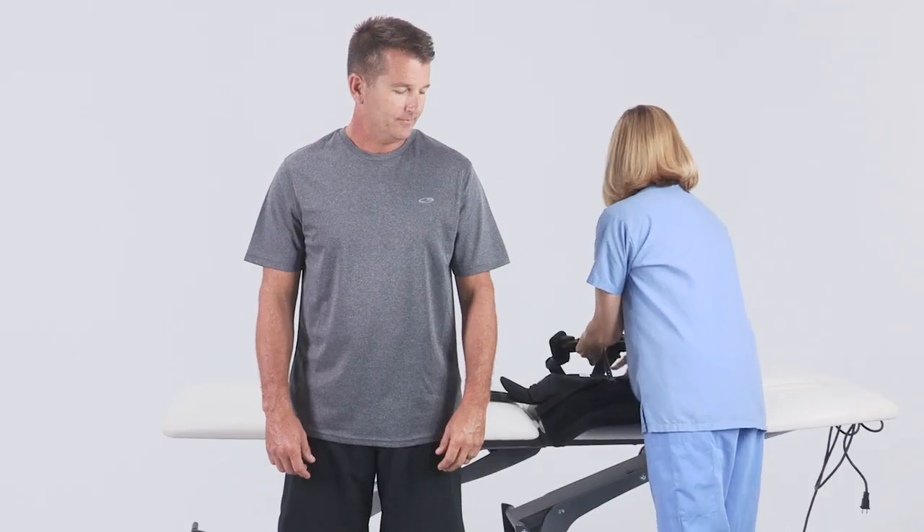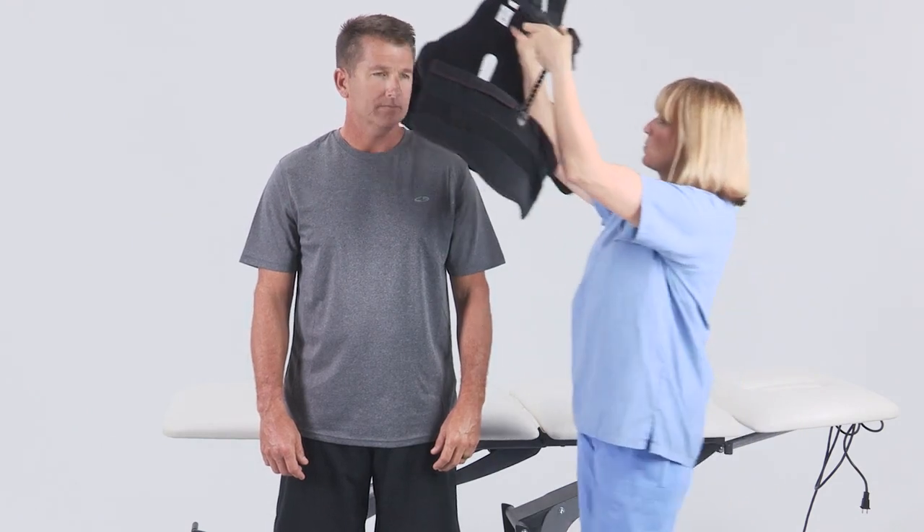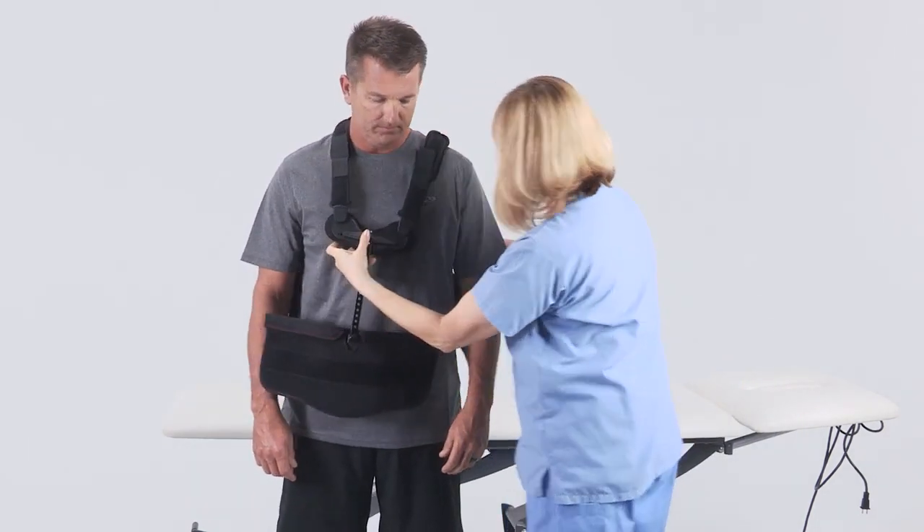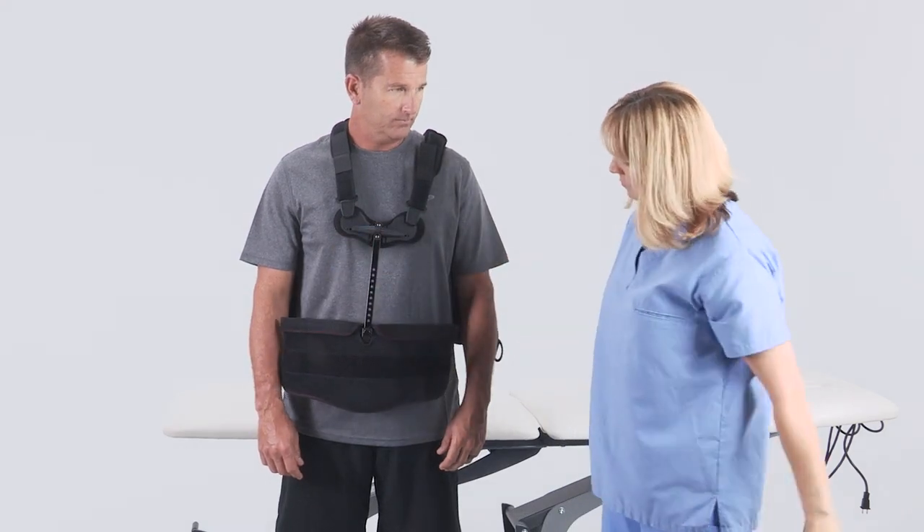With patient standing, lift the TLSO over the patient's head and lower the TLSO into position. Let the front panel and back panel hang over the torso.